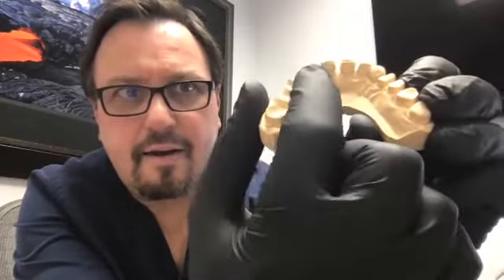You can kind of see the design of the preps right there. You can kind of see it. So that's kind of good. So basically, the front are feldspathic porcelain.